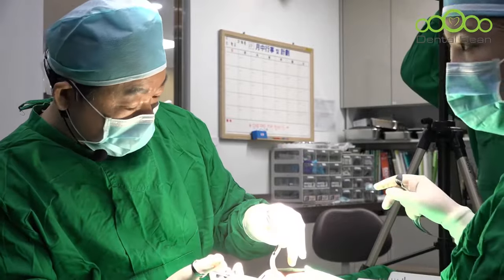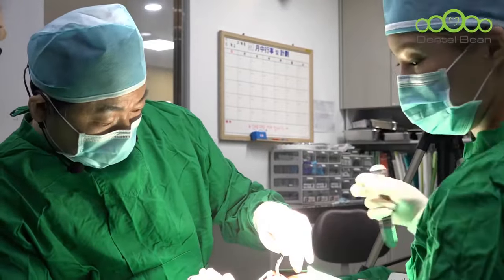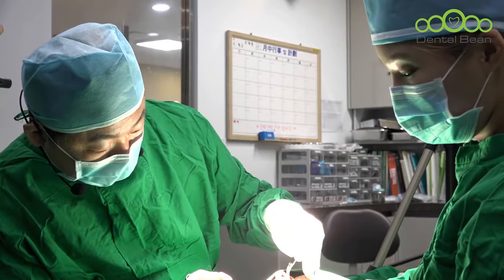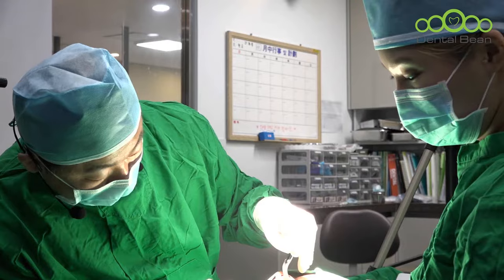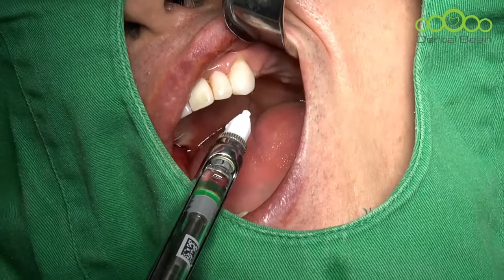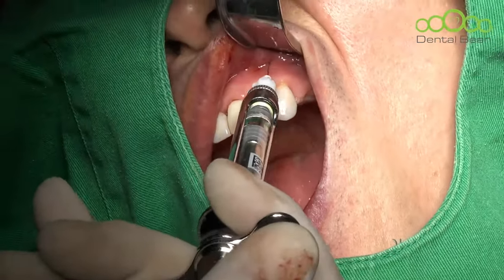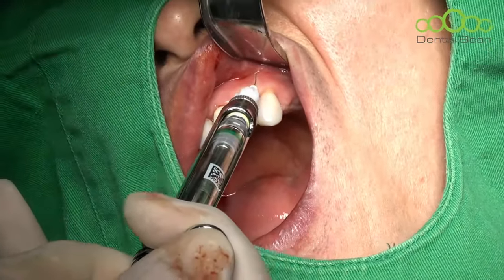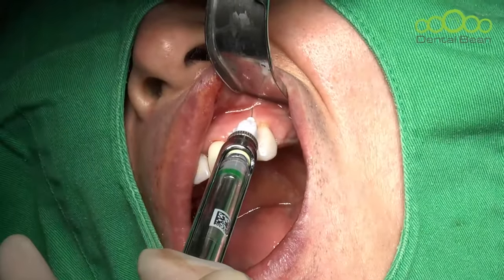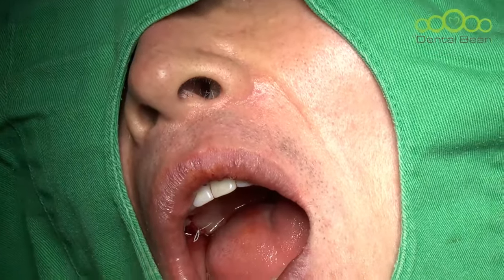Okay. Left side bone height was very poor in the CT view, so I'm planning lateral approach sinus bone augmentation. Okay, let's start. Blade.